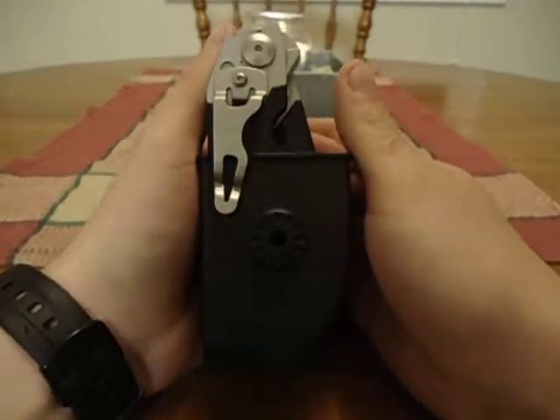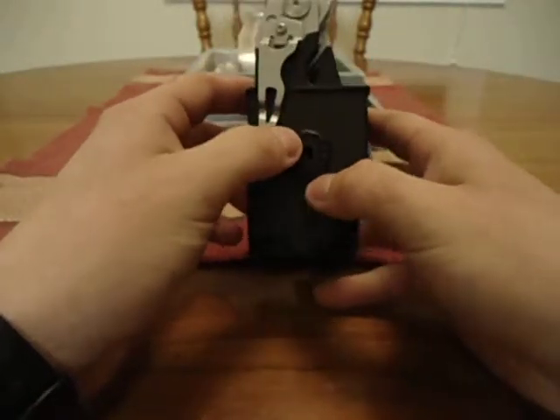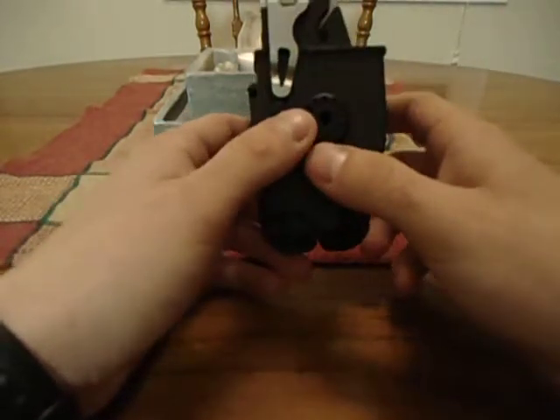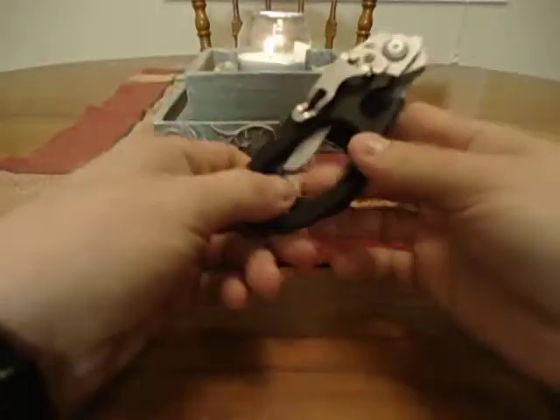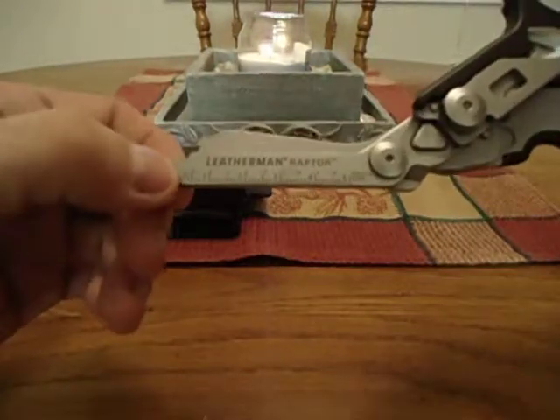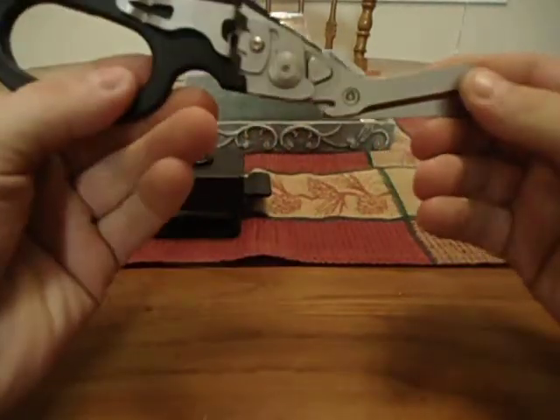Back with a review for the Leatherman Raptor. This review is going to be kind of short — not much to go over, just a couple things I like, a couple I don't like, and some things I wish they would change. The Raptor is a medical trauma shear. If you don't know what trauma shears are, they are medical scissors — and these are badass, definitely the best ones I've ever owned.